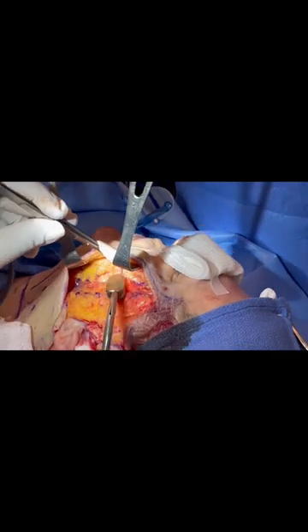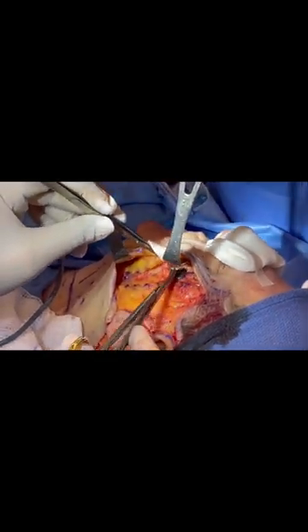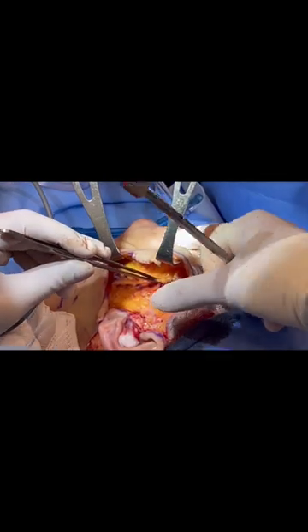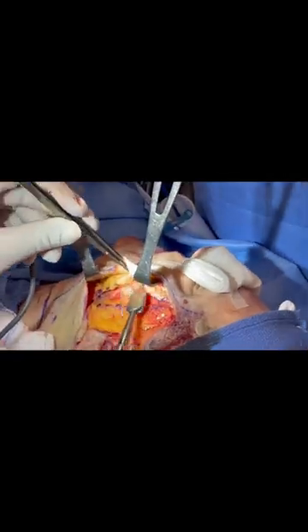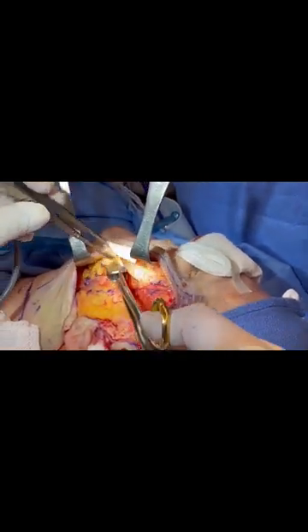My inferior extent of this dissection is the posterior platysma that we have already dissected off the angular mandible and the border of the sternocleidomastoid muscle.